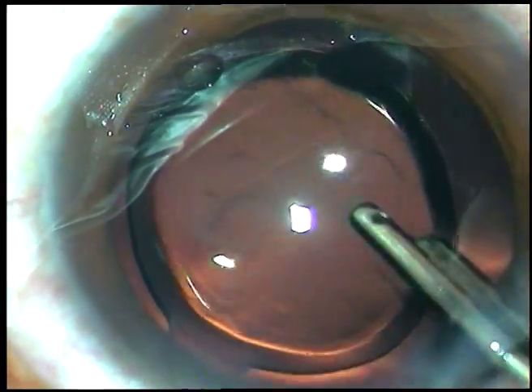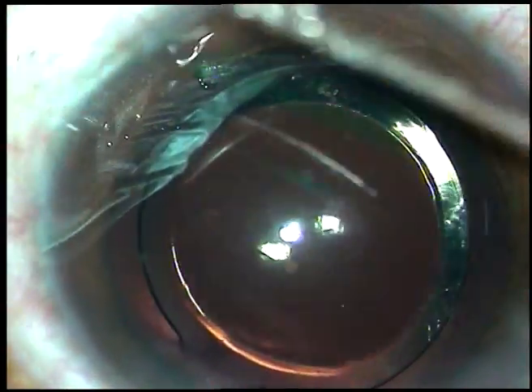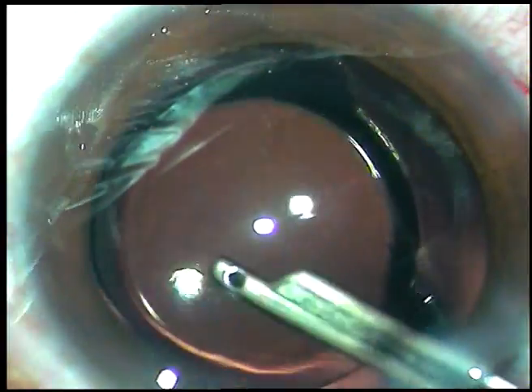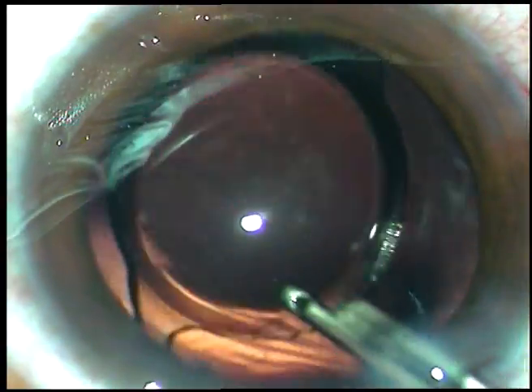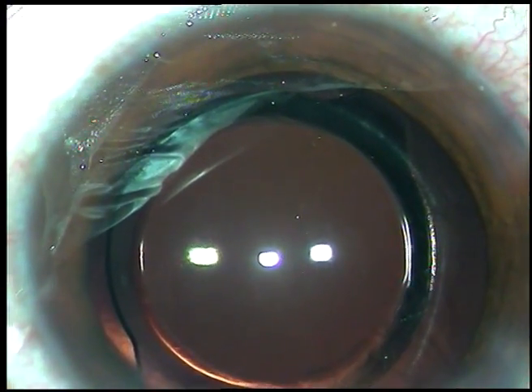So, if you want to use Alcon lenses, go for Acrysof Single-Piece — not IQ, not Acrysof Multifocal. And now, I am going to remove all the viscoelastic substance that has been injected into the anterior chamber and capsular bag.